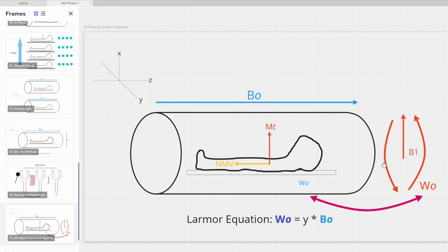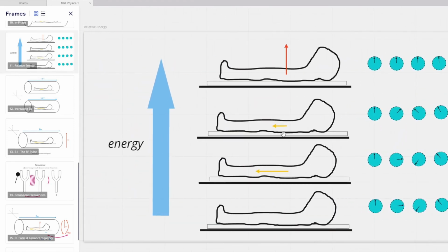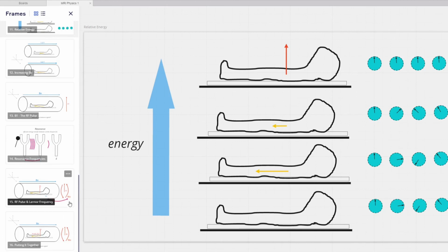So if we set our external field over here to flip back and forth at that same frequency, what's going to happen? Because we're applying this field with some frequency that is equal to the frequency of the things that we care about in the patient, this situation allows for efficient energy transfer between this field and the patient, such that we're actually able to get up to this point. It's the principle of resonance that allows that.